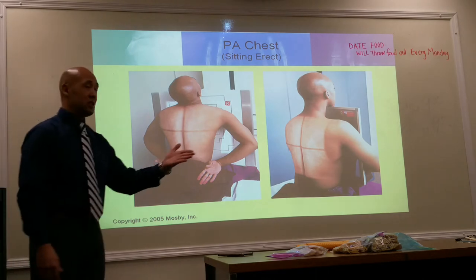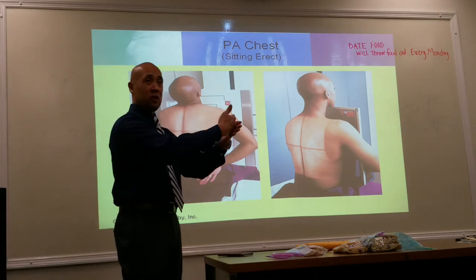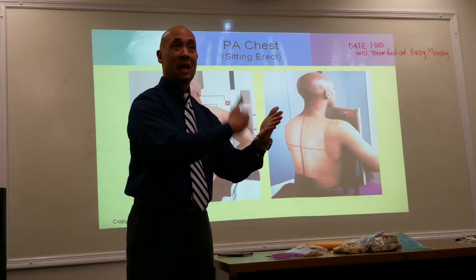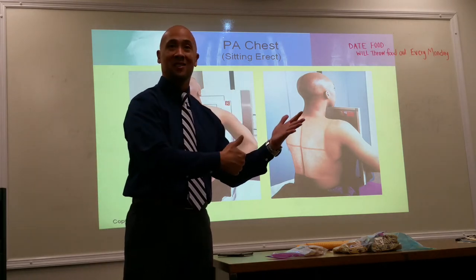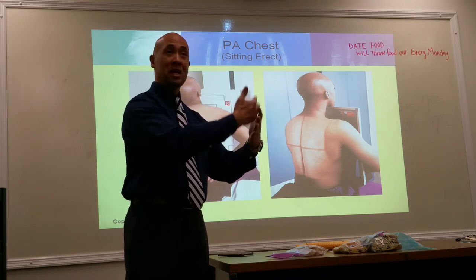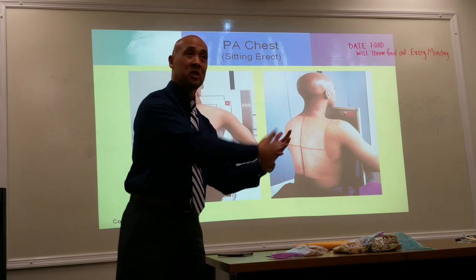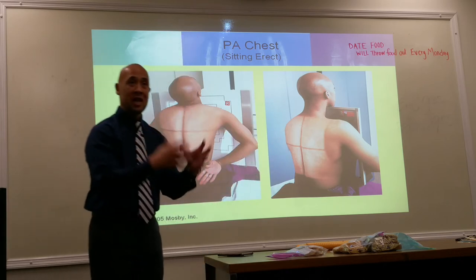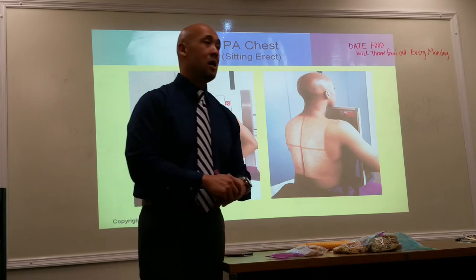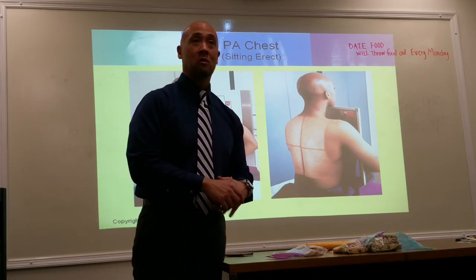And as you're doing this, on your category for chest, you will probably have about 20 sets of techniques that has been given to you by 20 technologists, okay? And so you just kind of pick and choose which one works for you, for your style, and then narrow it down as you guys progressively get better and better and you become more solo.